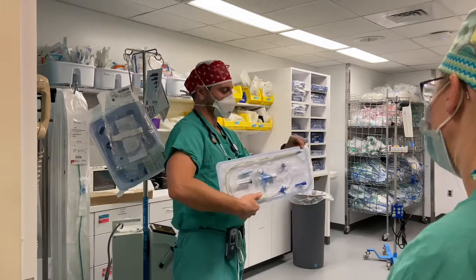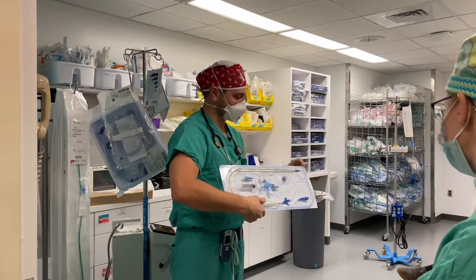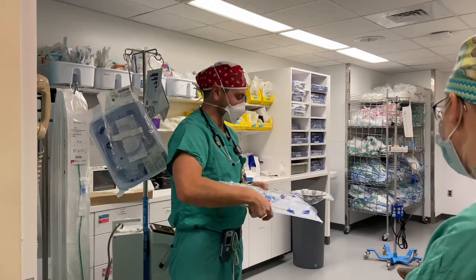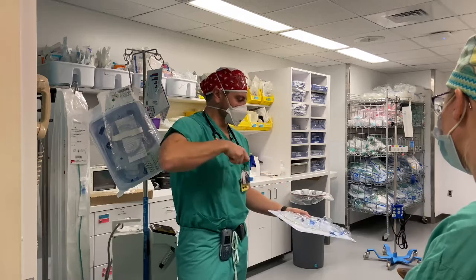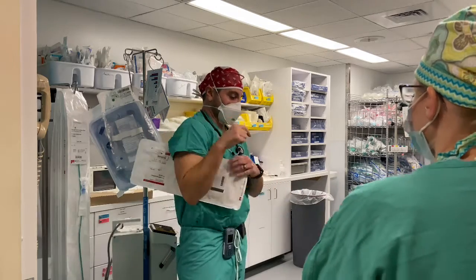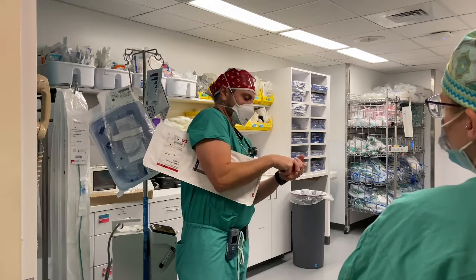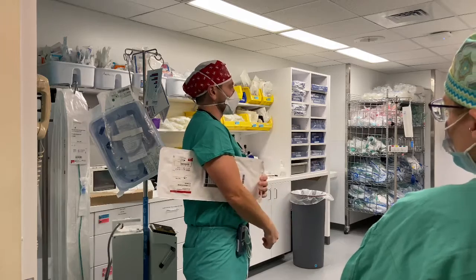The other thing that they'll do is they'll hook this up to the patient before I even go there. There's a little loop at the end of this bronchial blocker. Okay, if you guys have looked at that, there's basically a little thread at the end with a loop that, if you pull on this white connector at the top, it cinches that loop down. And so it's designed for you to put the fiber optic scope through that loop and then cinch it down so you can drive the scope and drive the tip of the blocker wherever you want it to be.